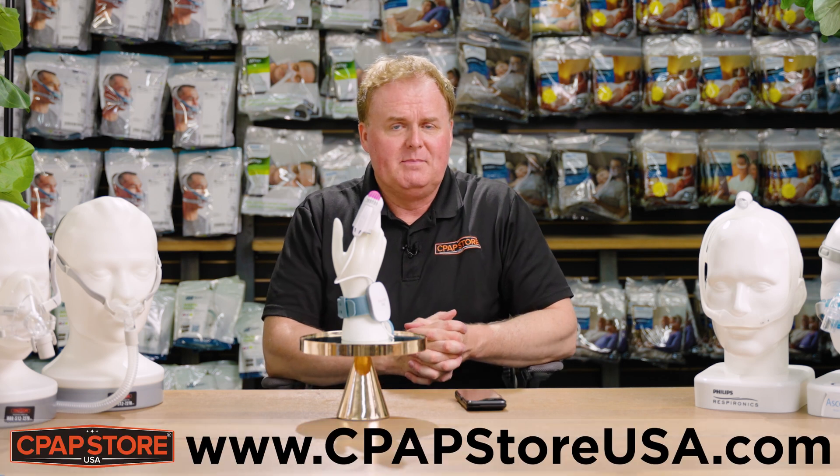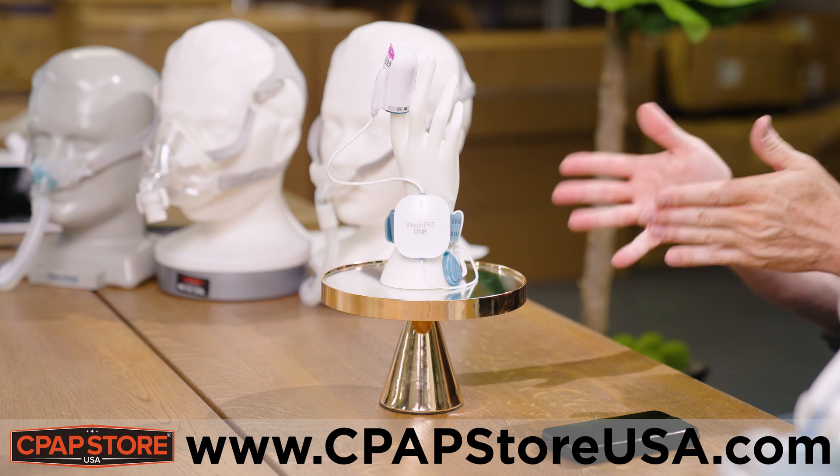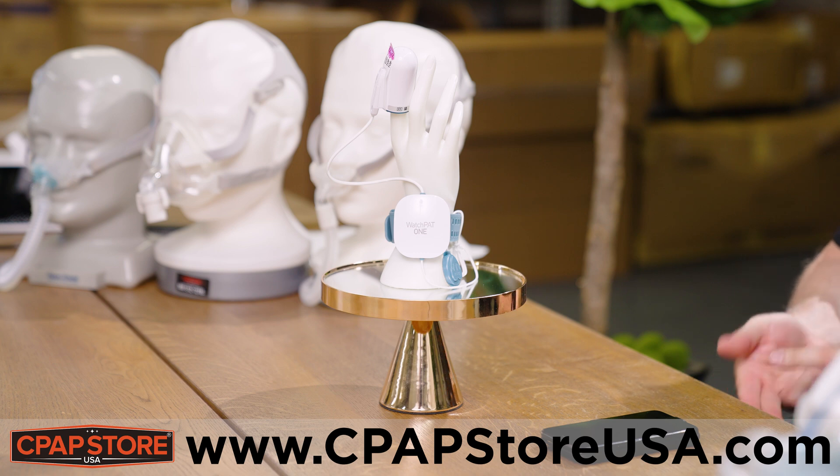Hi, I'm Scott with the CPAP Store USA. I'm excited to show you our new WatchPAT home sleep test. It is disposable and used once. It can differentiate between central sleep apnea and obstructive sleep apnea. Basically, you use it at night — it attaches to your hand and chest like so.